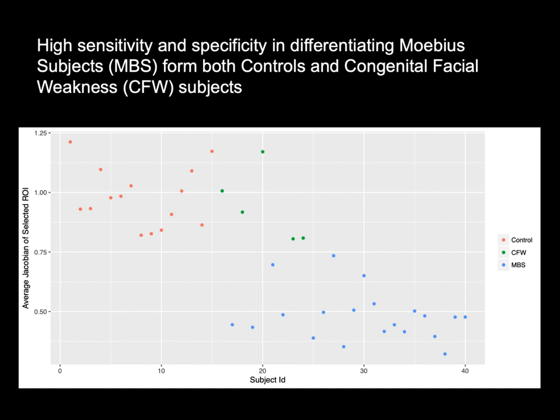Exactly. The other point is the common template that you generate just from the control group. If you have a large number of subjects, you can do everything you want. If you have a limited number of subjects, then these are all very valid questions. So we typically, if we have a balanced number of controls and patients and the anatomical differences are not huge, it's wise to actually do a population template.